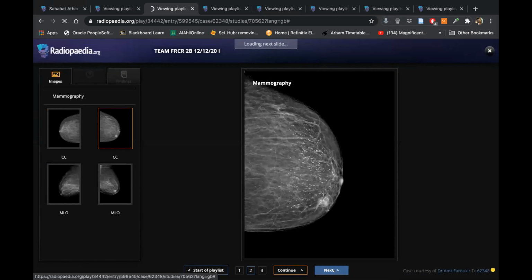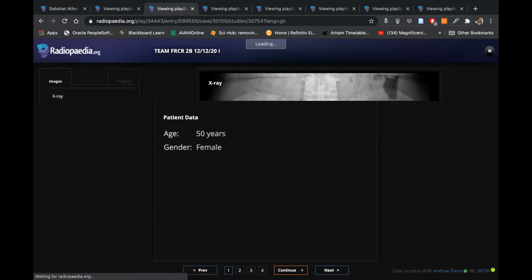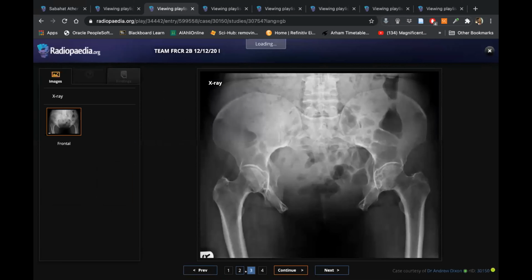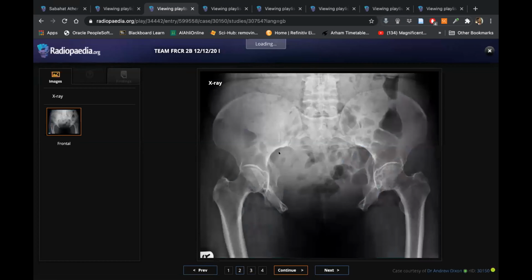This bladder exstrophy case, you did perfectly. The word which I wanted to listen to, and I think the examiner would also like to hear, is manta ray. And like lots of things, okay, what is manta ray? I didn't know. So this picture for you, this is manta ray fish. So this is how the bladder exstrophy would look like. And you rightly said everything.